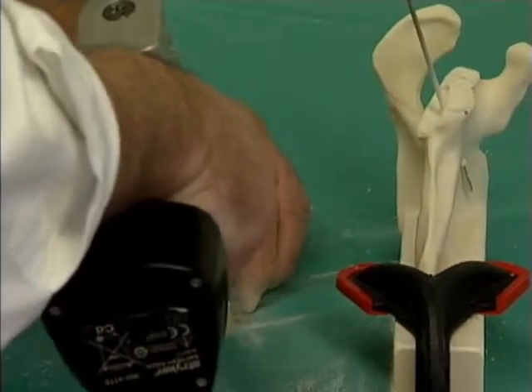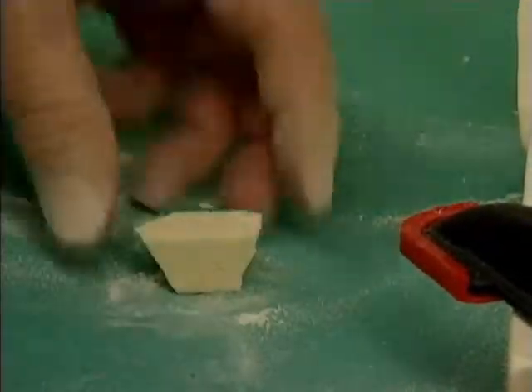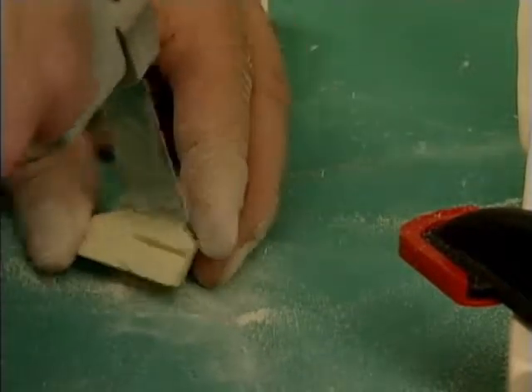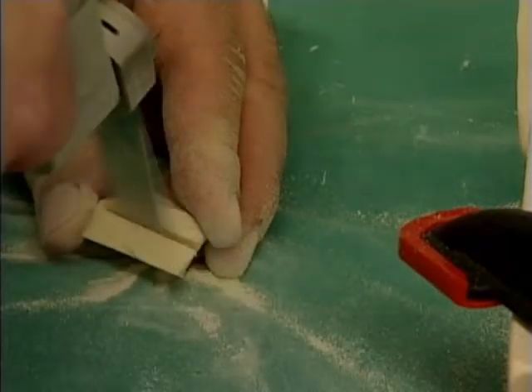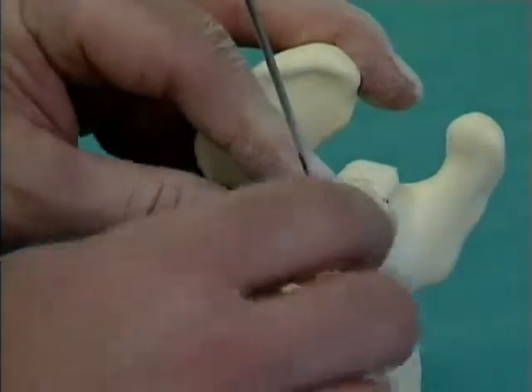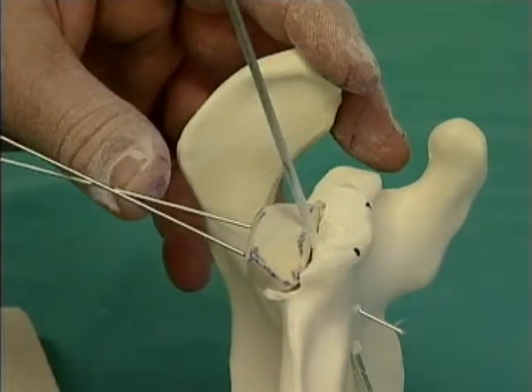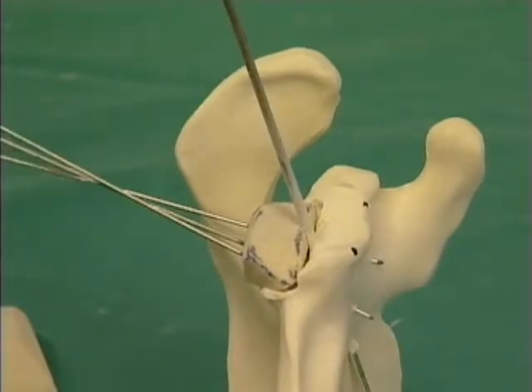The graft size used for the defect is slightly larger than that which is needed for the final dimensions, as this graft is ultimately reamed after it is placed on the glenoid surface. The graft is then placed manually and guide pins are placed both superiorly and inferiorly such that they avoid the center peg of the glenoid. An additional third pin is placed in the center.